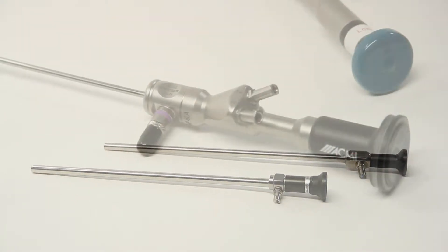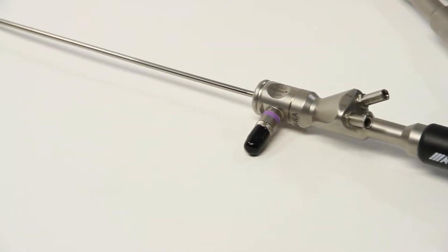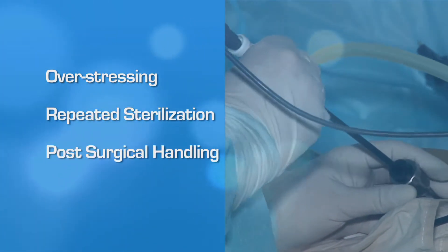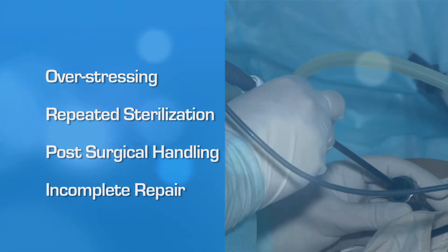By their very nature, endoscopes are prone to failure from many causes: over-stressing, repeated sterilization, post-surgical handling, or incomplete repair.